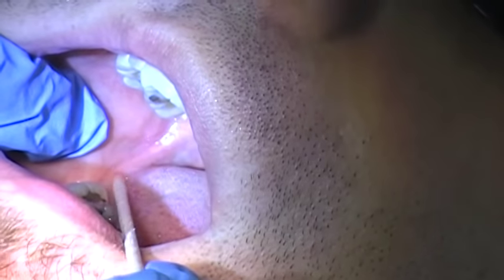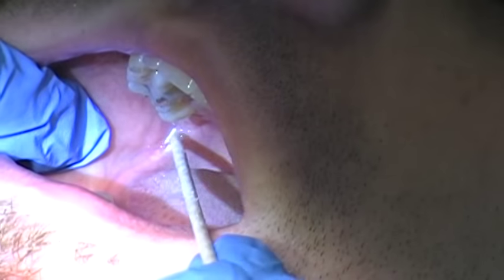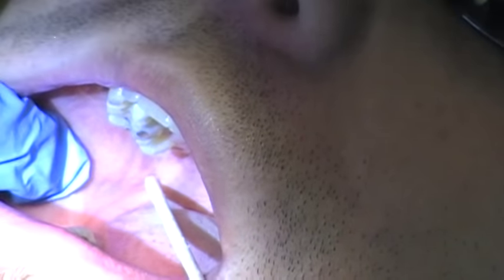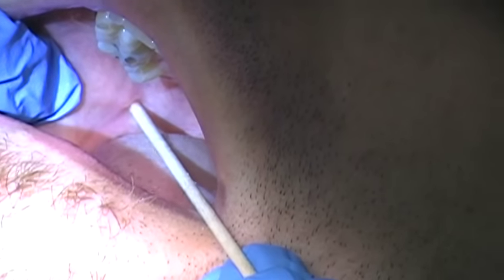It goes straight and then it starts to curve — go towards the top of the straight part. Another way to look at it is to divide the raphe from top to bottom, and the site is usually about two thirds of the way towards the maxilla. You want to be right next to that raphe with your site.